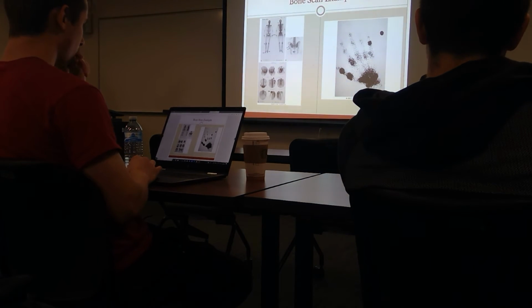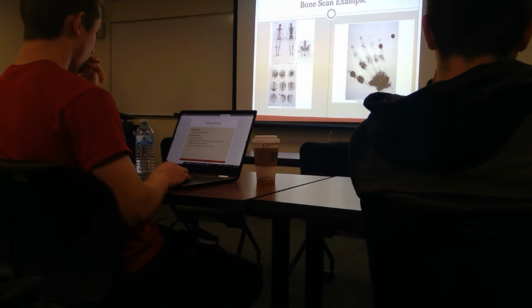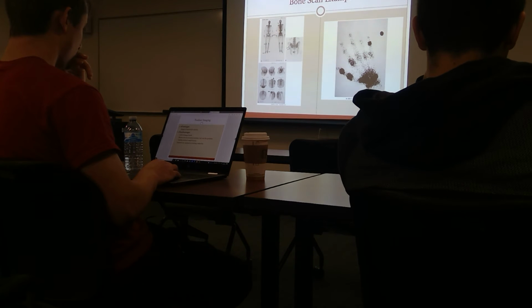Okay. If we look up here, we see lots of areas highlighted. Ankle, knee, pelvis, both shoulders and parts of the spine, front and back. That's showing us multiple examples of just degenerative joint disease. You don't know whether it's RA or OA, but the joints are swollen in all of those areas.